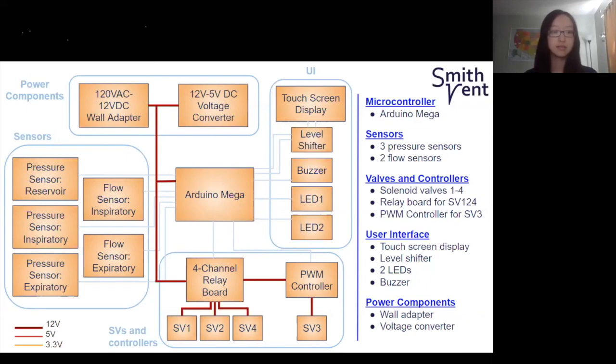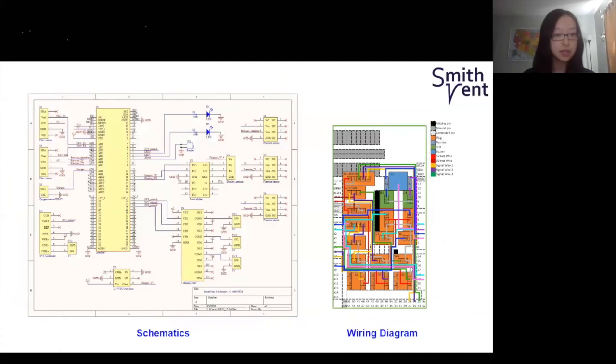controllers. The sensors are powered by 5 volts from the Arduino, as well as the buzzer and the LEDs. While the touchscreen is powered by a 5-volt regulator due to its high current that the Arduino can't supply. The level shifter, which converts logic signals, is powered by both 5 volts and 3.3 volts from the Arduino. The whole electrical system can be professionally represented by schematics and a wiring diagram, shown here on the slide.